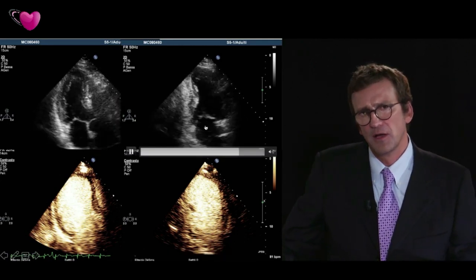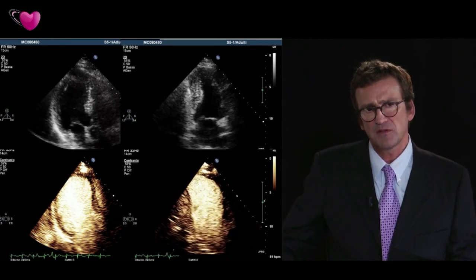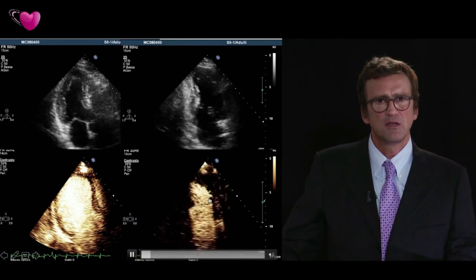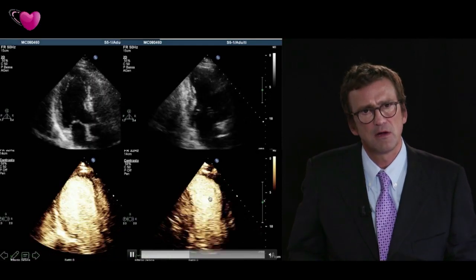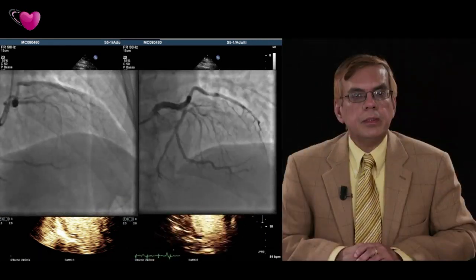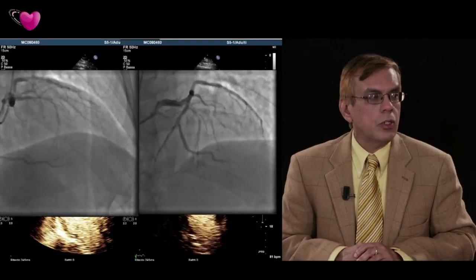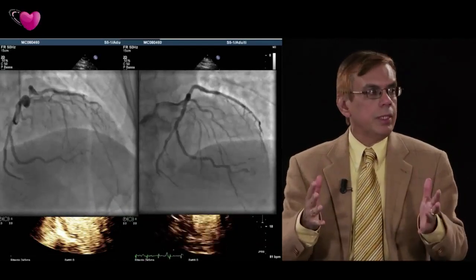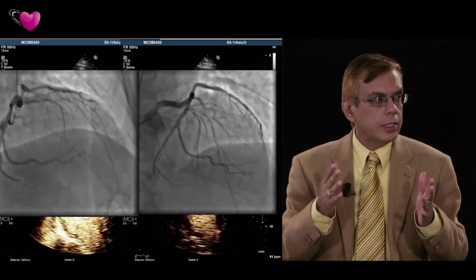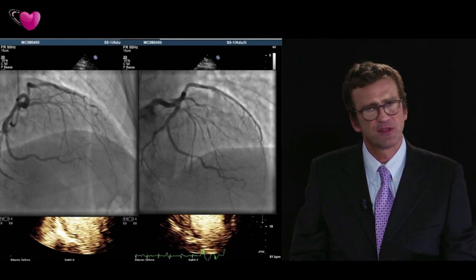So in this two chamber view, you see nothing wrong. But if you use contrast, you probably move a bit, and you can see that all the apex here is hypokinetic. So you are able to diagnose something wrong and not send this patient home. That was a great example: if you had just looked at the wall thickening without contrast, you would say it's a perfectly good image. I think this happens quite a lot. You have foreshortening, and that's why you're seeing it that way. You must use contrast to see the apex well. Yeah. So let's see the second and last case.